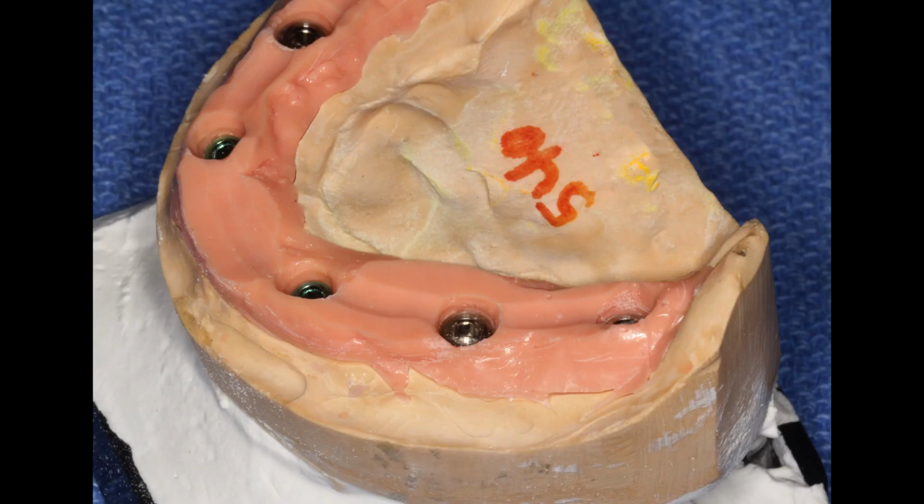This is the lower master cast, and I wanted to show this to show you how we modify the pink. This is actually called polyvinyl siloxane. It's a soft tissue replication of what the patient has in their mouth. And you'll notice this trough that we create. We actually modify this model ourselves before it goes to the lab.